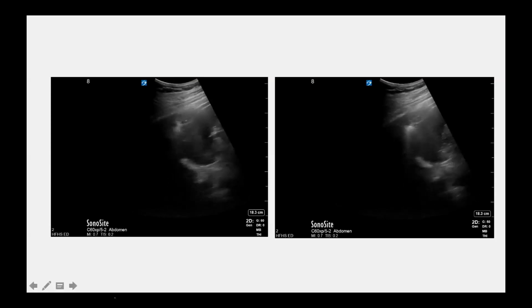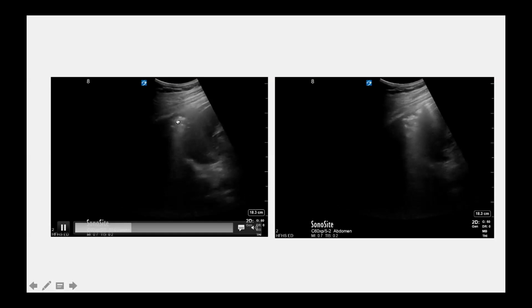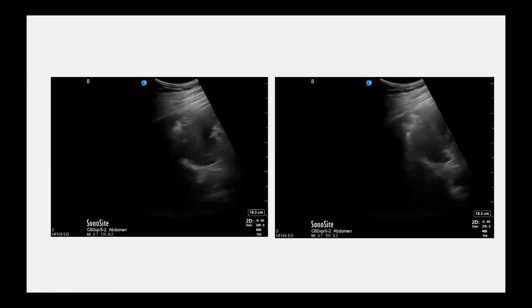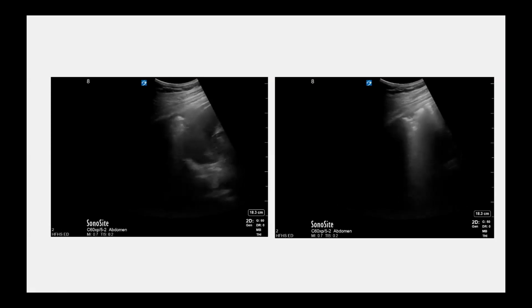Yeah, look above the diaphragm to evaluate the costodiaphragmatic recess. Yeah. Is it talking about pleural line? I'd like you to be a little bit more specific. Talk about visceral pleura, or parietal.